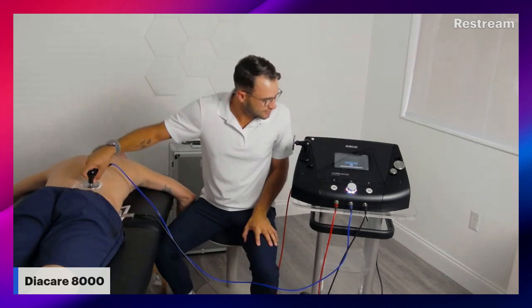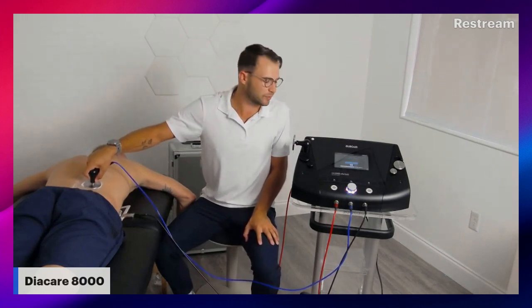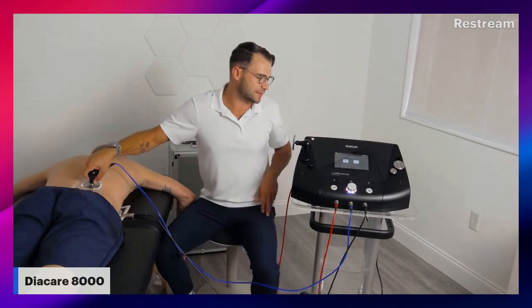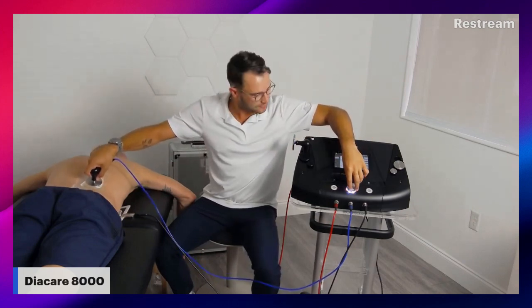So there's a loading screen. It's going to tell you just to hold the head of the electrode exactly where you're going to be treating, so it can start reading that impedance and make sure that the patient is nice and safe and prevent any kinds of zips. So once again, same similar situation.